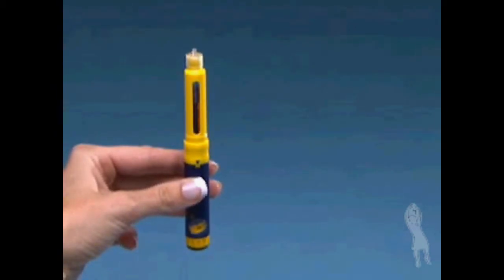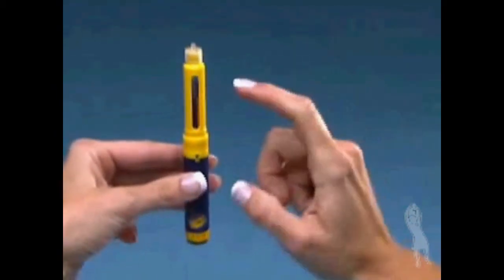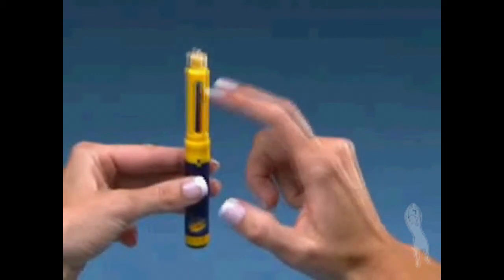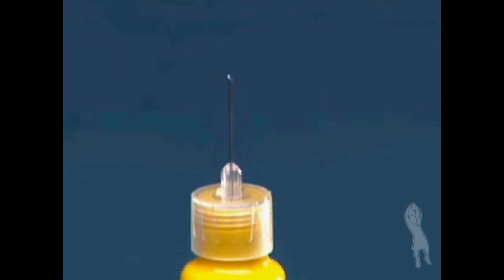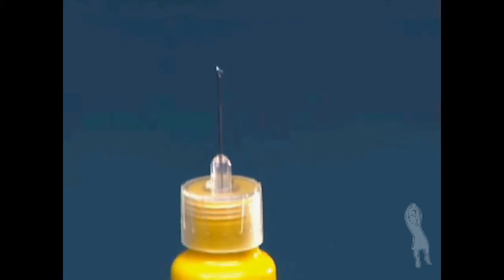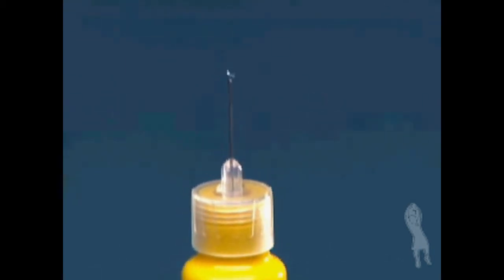Hold the Follistim Pen with the needle pointing upwards. Tap the cartridge holder gently with your finger to help air bubbles rise to the top of the needle. Look for a droplet forming at the tip of the needle. If you see a droplet, go on to the next step.